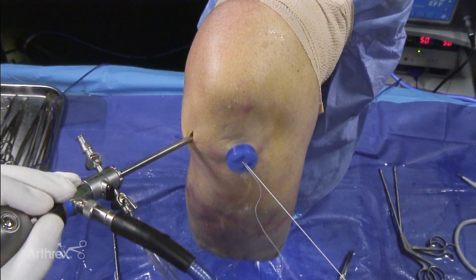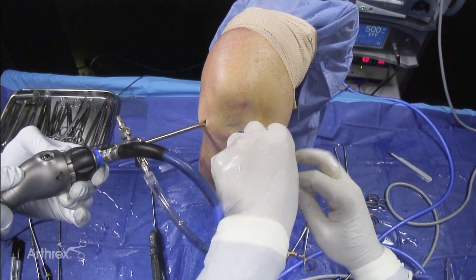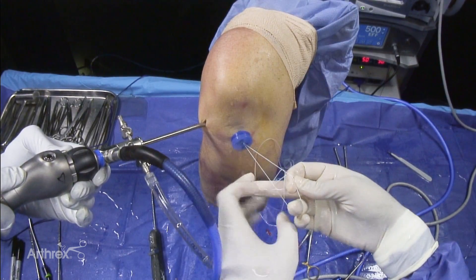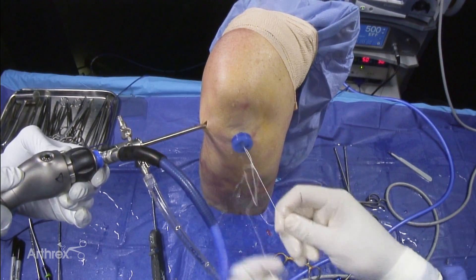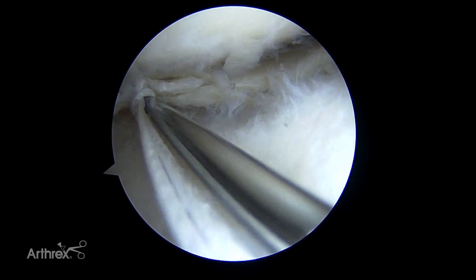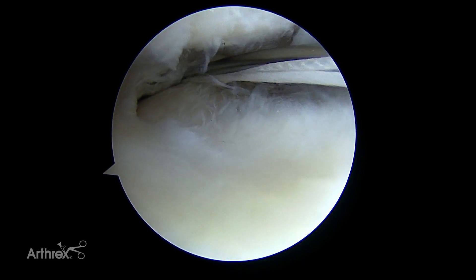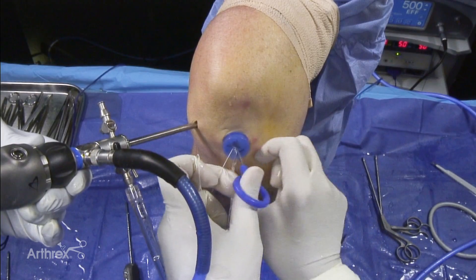I'm going to tie a little sliding knot here. With this O fiber wire, we tie a knot and then we're going to push the knot into the back of the meniscus — pushing this into the very back of the knee under the capsule.